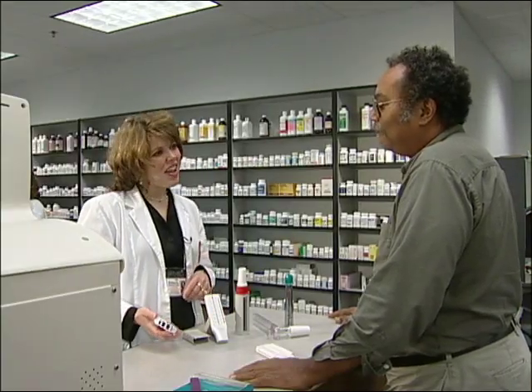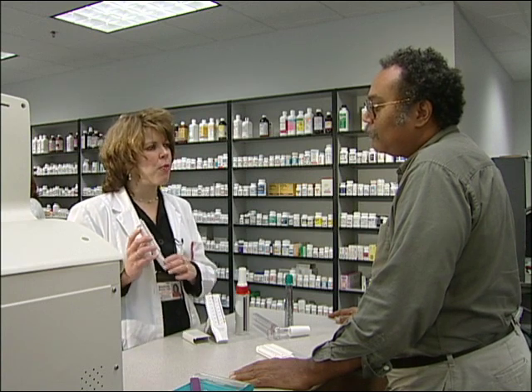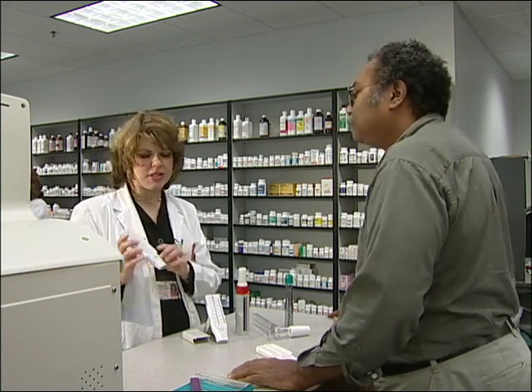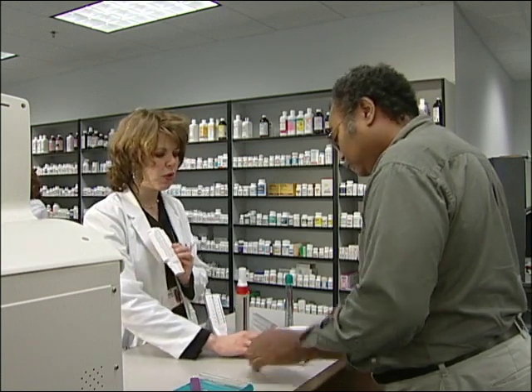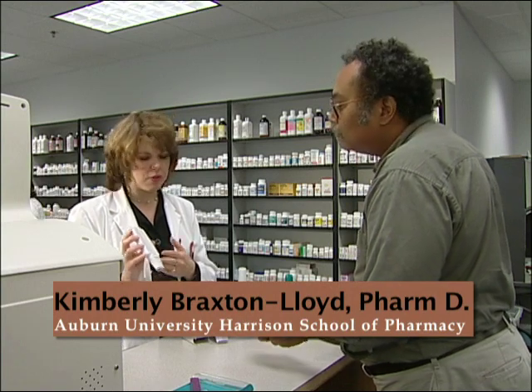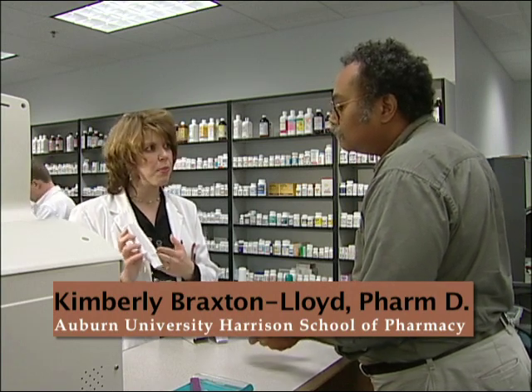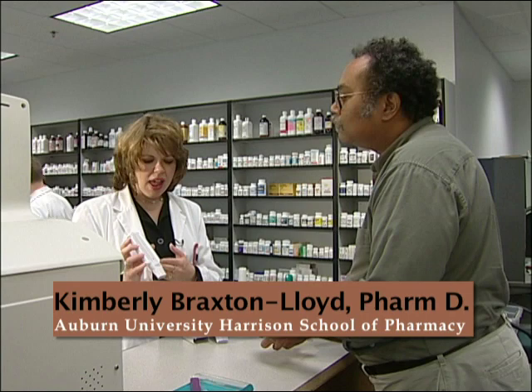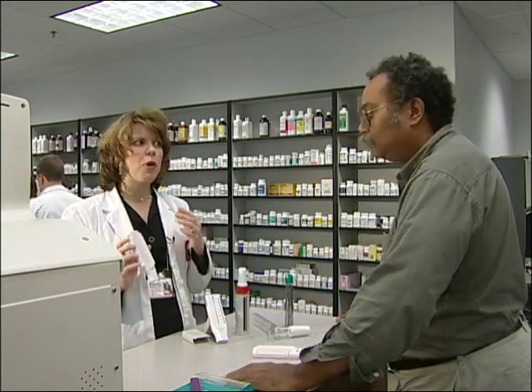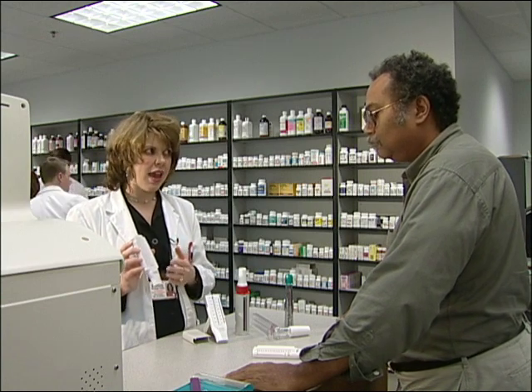Good morning. It looks like your doctor has prescribed a peak flow meter for you to use to monitor your asthma, and I've selected one called an Asthma Mentor for you. I want to show you how to use it at home to make sure you're familiar with how to use it appropriately. It's very easy to use. Basically, you just blow out into this meter as hard and as forcefully as you can.